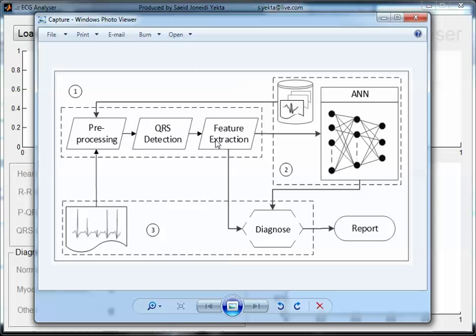After the measurement, a data table is created and passed up to the artificial neural network for training. After the learning part finishes, a net file is generated which later in the user interface we use for the diagnosis part.